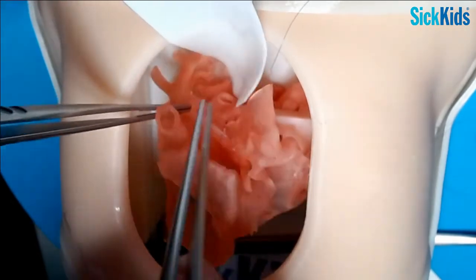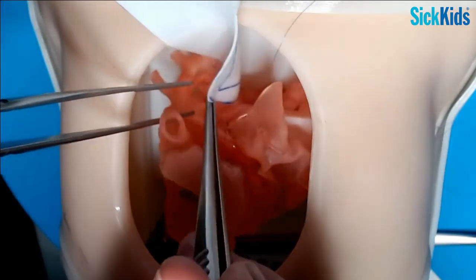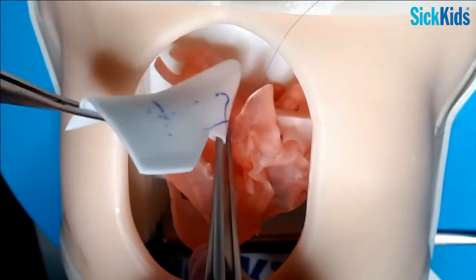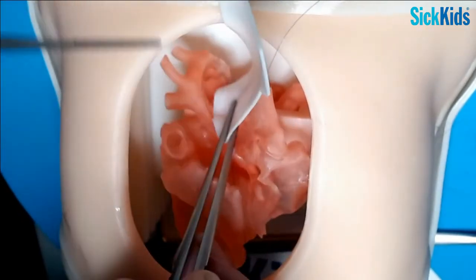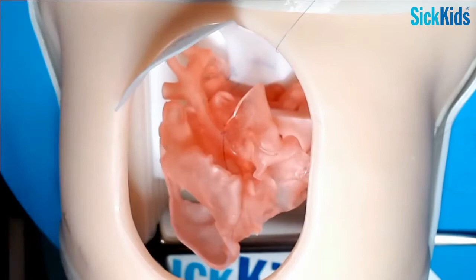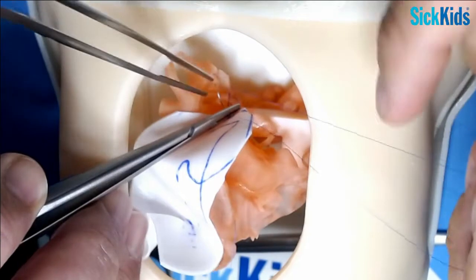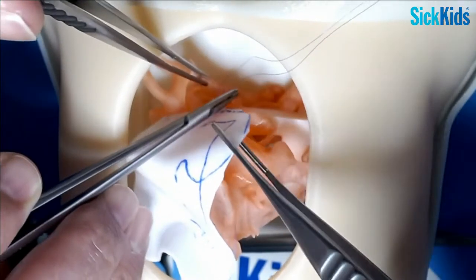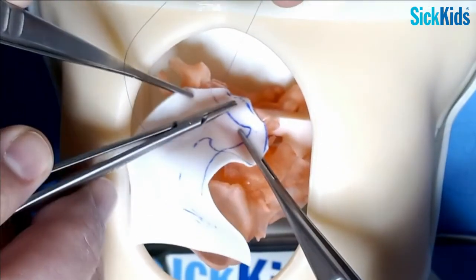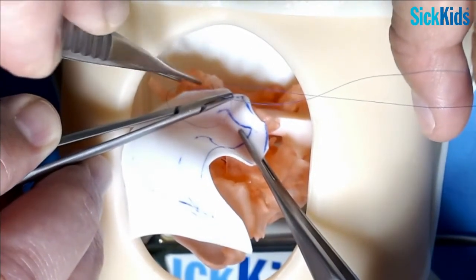This one, so you have to fill this corner right here, so you need this little bulge to fold over and fill in that corner right there. It's a little bit wide, so we know we're going to have to narrow that a bit. But that's what you're looking at, how does this fold like this without kinking. So this material's a little stiff, but those are the things you're thinking about. So I'm going to take big, massive jumps so we don't take forever sewing, but enough to tack it in place and give us an idea of what we need to do.